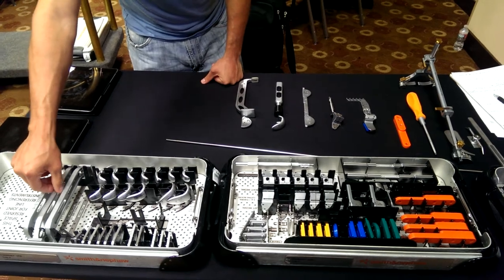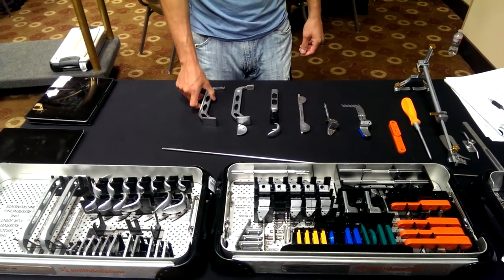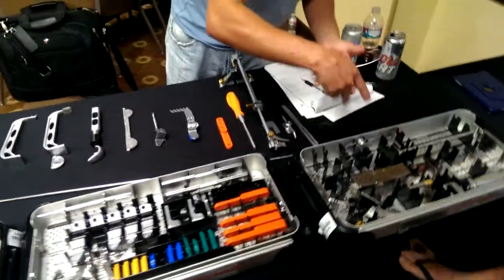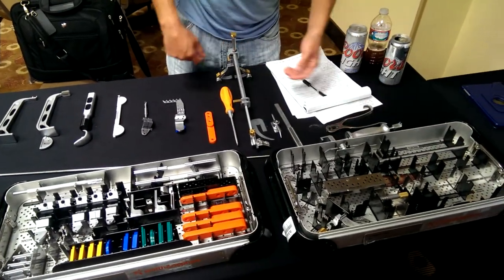And we've got our size 3-4 tibial plug punch. And then other instruments we may need: pin puller and slap hammer. Ta-da!